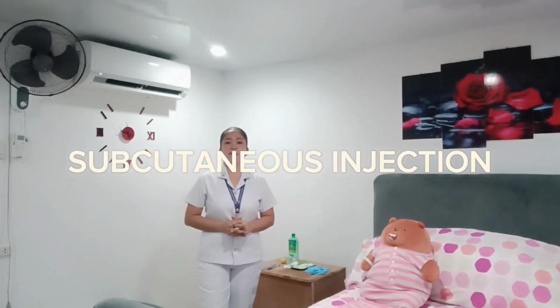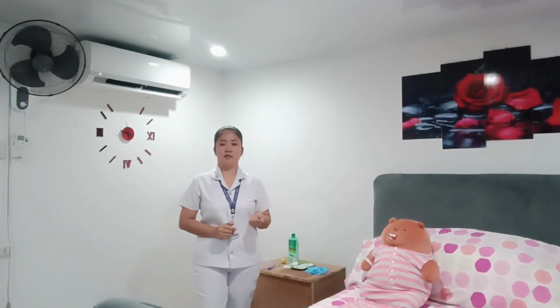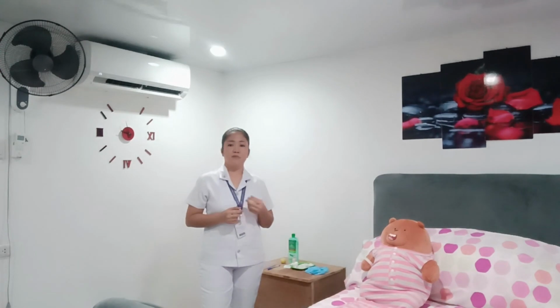Good day everyone, my name is Mark Garcia and today I'm going to show you the procedure, the process of subcutaneous medication. But before that, we have to check the doctor's order, check the medication administration record, and check the label of the medication carefully to make sure that the correct medication is being prepared.